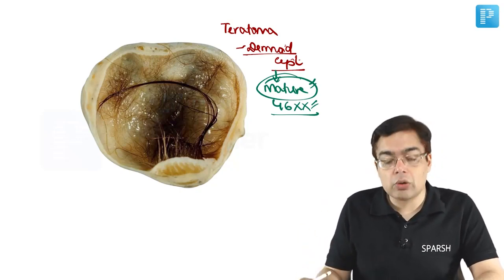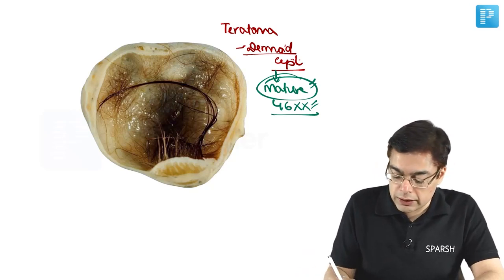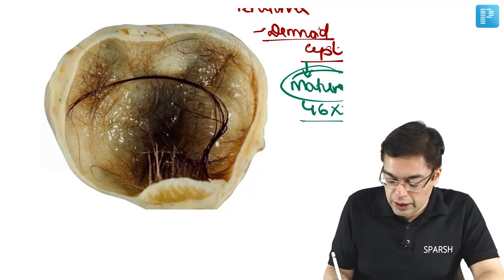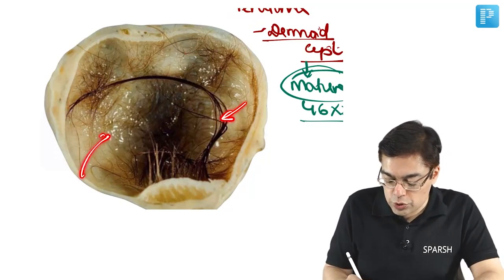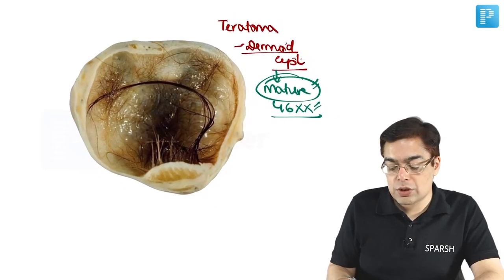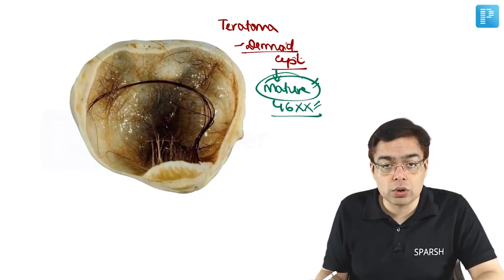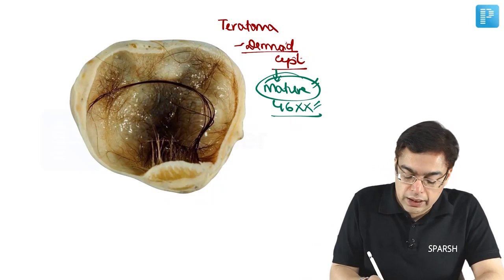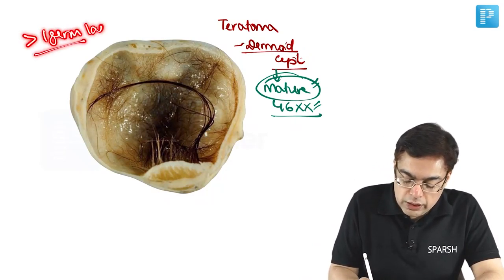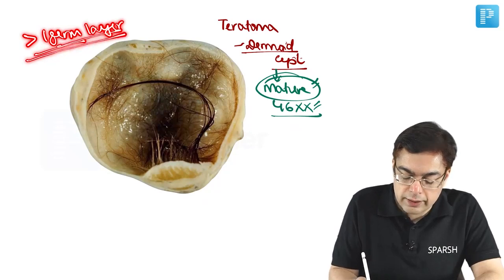Now, to talk about a teratoma, it is easy for us to appreciate the fact that you are obviously able to find the presence of skin, hair, mucin, adipose tissue, cartilage, and tooth. So practically, just rewinding and talking about the fact that this is going to have an origin from more than one type of germ cell layer.